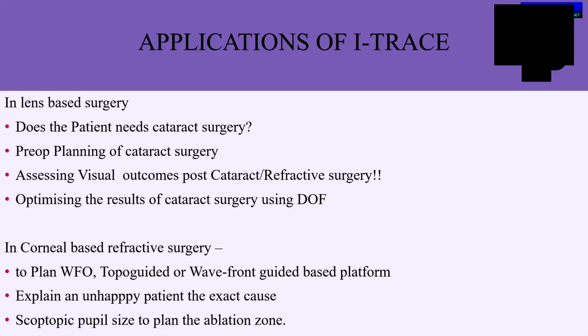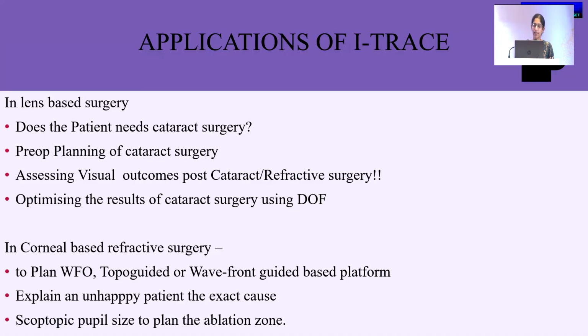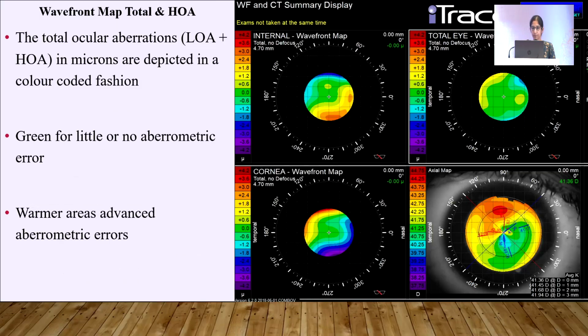Does the patient need cataract surgery? Preoperative planning of cataract surgery, especially with EDOF and multifocal IOLs, assessing the visual outcomes in terms of contrast sensitivity, and can we optimize the results of cataract surgery using the depth of focus curve.